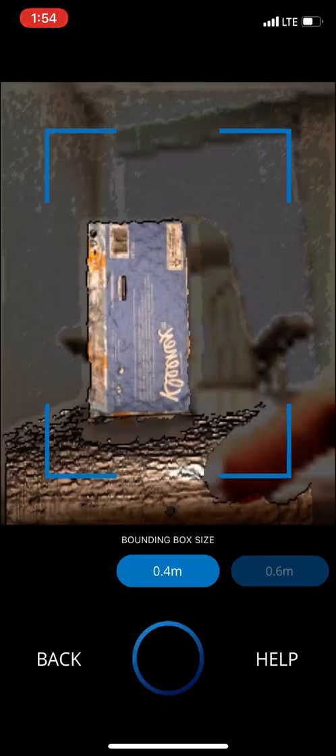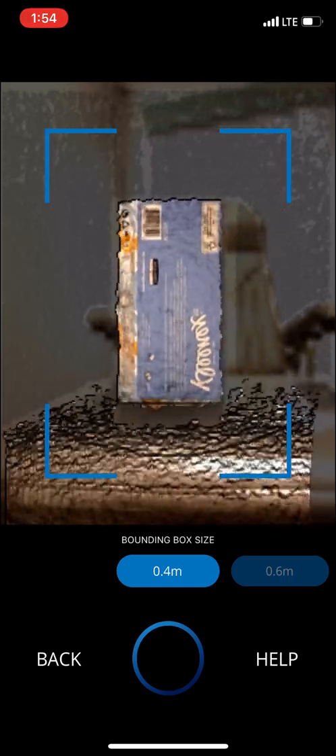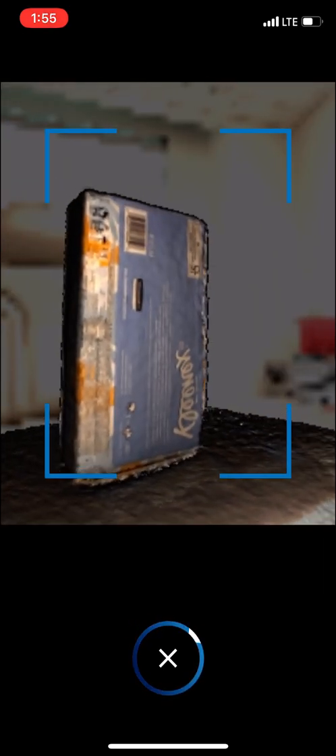I've got the Kleenex box within the blue bounding box here — this is a guide to keep what you're scanning in the center of the screen. I'm going to start with the volume button. Now it's starting to scan. I'm going to move it around — if it flashes red, that just means to slow down and wait for it to get a nice image. I'm going to come back over to the other side of the Kleenex box and also go up on top. Let's stop that.